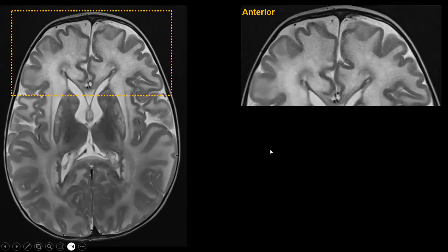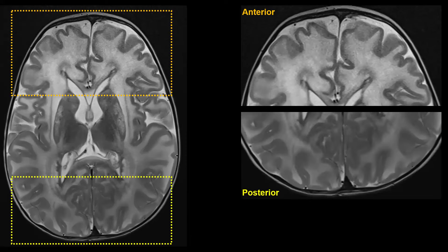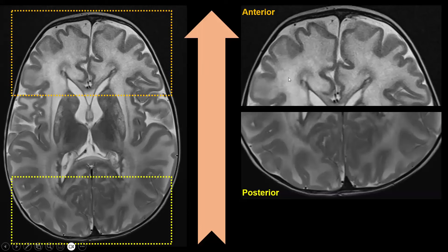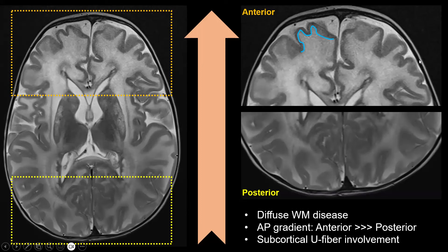Looking at the T2 weighted images in detail: in the frontal lobes we see diffusely increased T2 signal in the white matter, which shouldn't be the case in a one-year-old girl. Comparing to the occipital lobes, there are also signal abnormalities there but they are less pronounced — so there's a clear gradient. The abnormalities are most pronounced frontally and less conspicuous posteriorly. Furthermore, the cortex is normal, but the white matter abnormalities extend all the way to the cerebral cortex, meaning the subcortical U-fibers are also involved. To summarize: diffuse white matter abnormalities with a clear anterior-to-posterior gradient, and involvement of the subcortical U-fibers.